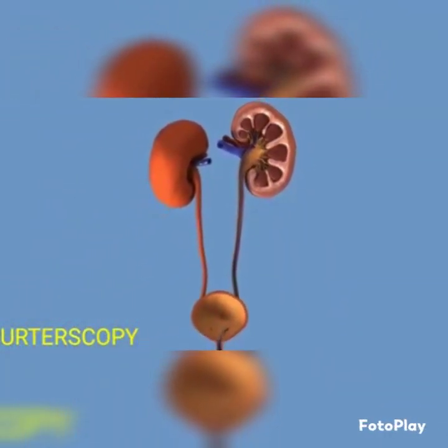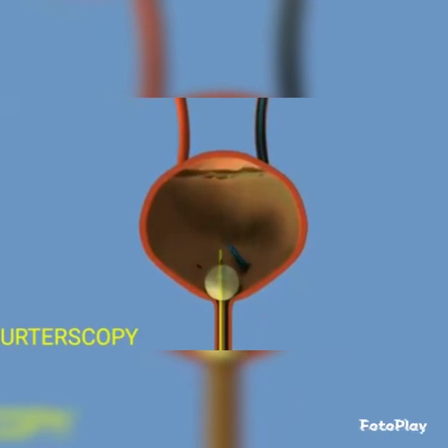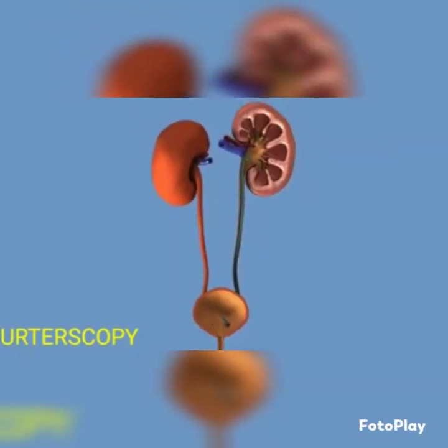Your doctor may place a temporary small tube, called a stent, within the ureter at the end of the procedure to ensure that swelling does not block the drainage of the urine. A catheter, which is a tube placed through the urethra into the bladder, may be used to drain the bladder. This catheter remains in place with the use of an inflated balloon. The catheter and stent are usually removed shortly after the procedure.